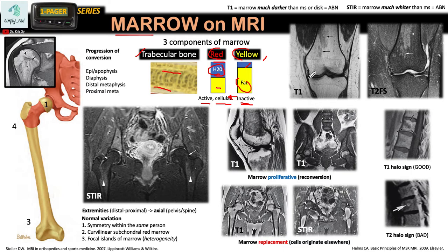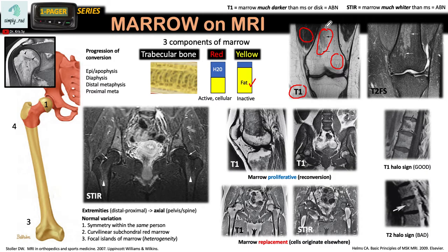On this T1-weighted sequence, the yellow marrow is bright because of its fat content, while the red marrow in the metaphysis is a bit patchy and darker compared to yellow marrow. However, comparing the red marrow with muscle, it is slightly hyperintense relative to muscle, because red marrow still contains more fat than muscle.